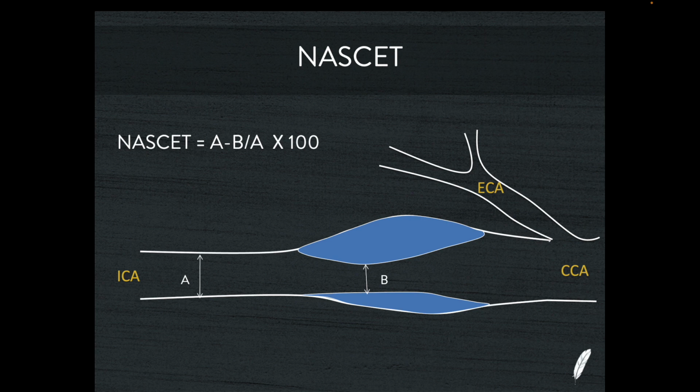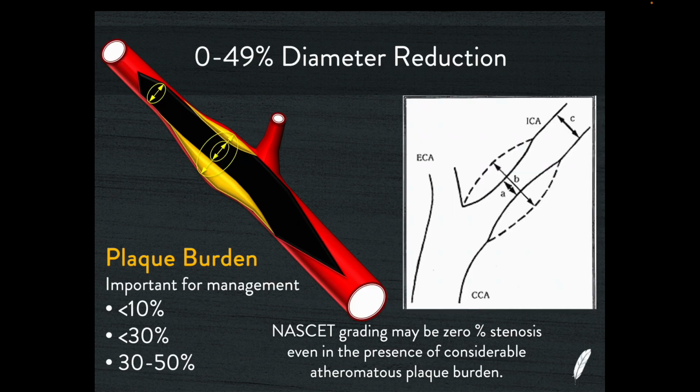So the case I'm going to show you is a case of exactly this type of phenomenon going on. This beautiful diagram here was made by the wonderful Martin Neckes, who is an absolute star when it comes to all things ultrasound, and he's very, very good at making schematics. You can see this quite beautiful diagram.